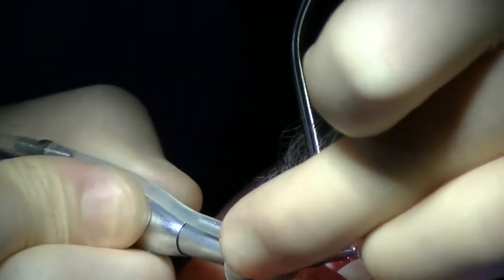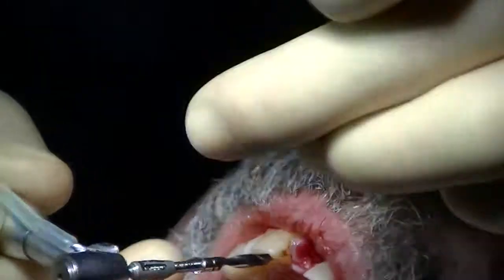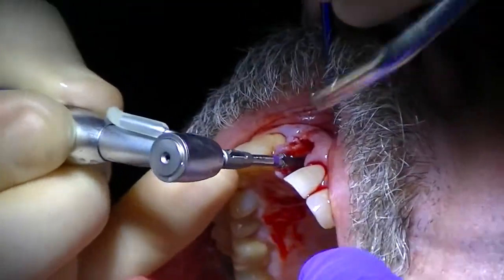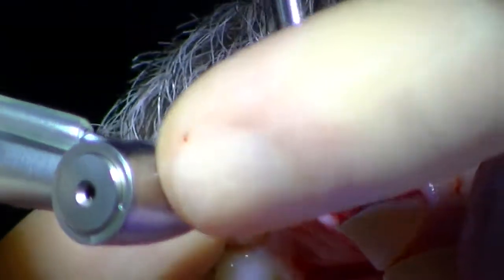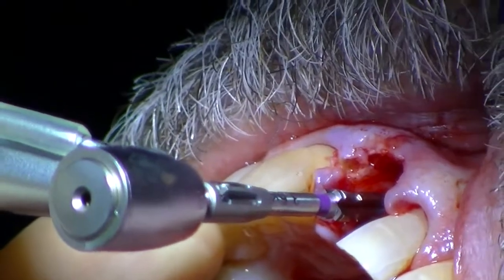And I want to go about 1 millimeter into that socket. You can stop and take a radiograph along the way. 3.5 diameter.